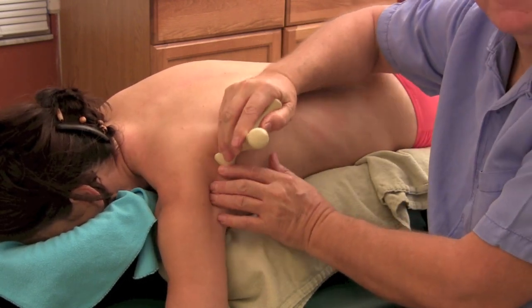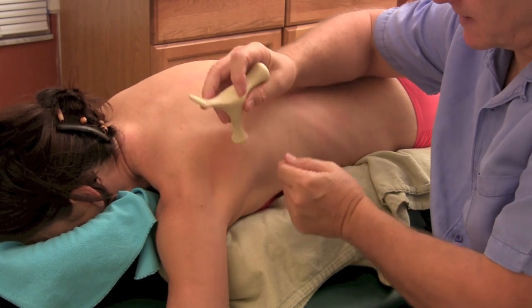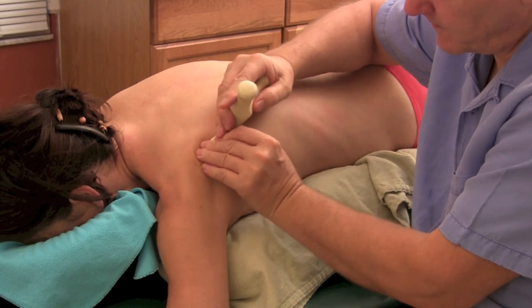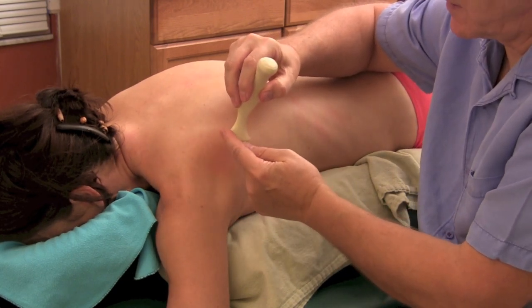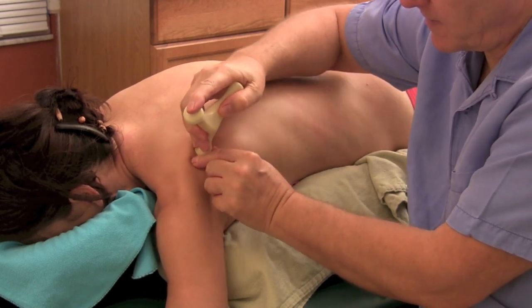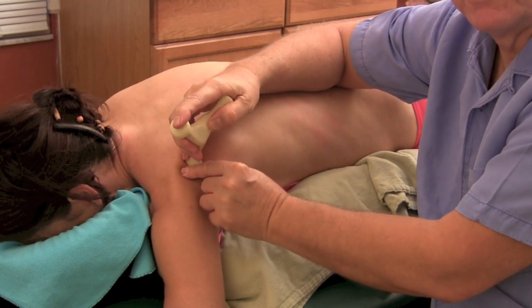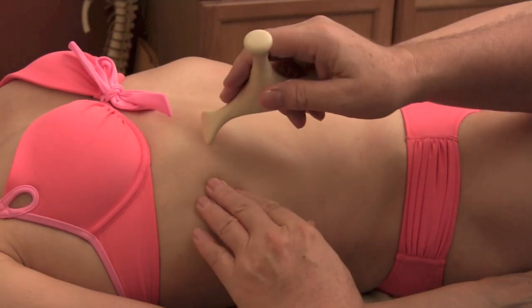Again, if it was a big person with a very precise trigger point, I could use that part of the T-bar and go right in, but no need for that on Kate. Now this pointed area on the tool — I can slip right up against her root of the scapula. There's a little area deep underneath there where trigger points will hide and constantly reactivate. That will fit right in between the ribs beautifully.